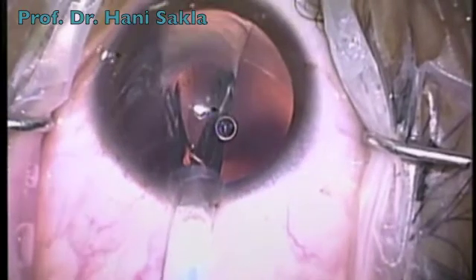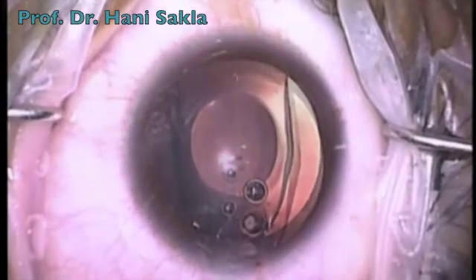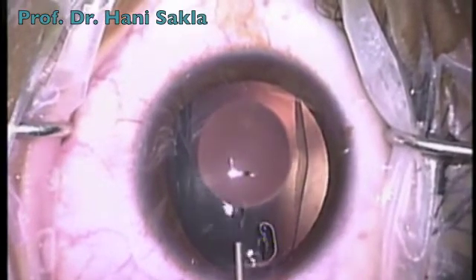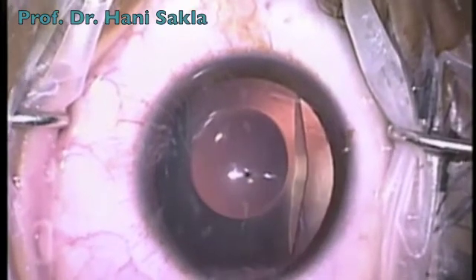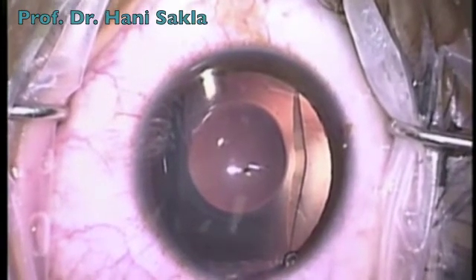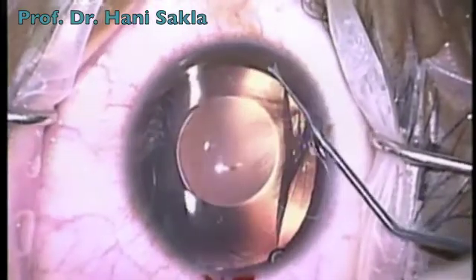Don't remove the tip of the cartridge from the incision until the distal haptics are completely unfolded. Then we add a few drops of viscoelastic on top of the ICL to push it downwards. Through the paracentesis with the special spatula, we place the distal haptics of the ICL.